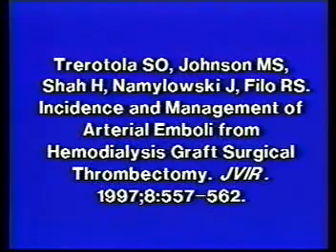A third fairly simple technique for treating arterial emboli is thromboaspiration. This requires the use of a larger catheter, such as a guiding catheter. If thromboaspiration, backbleeding, and balloon mobilization fail in an asymptomatic patient, we believe that no further treatment should be rendered. This has been published in the Journal of Vascular and Interventional Radiology in 1997.